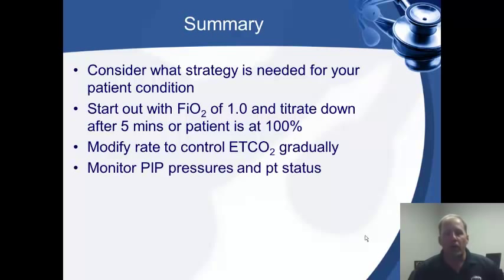Watch your peak pressures. We're shooting for 30 to 35. We don't want to go much over that. If we go much over that, probably in an obstructed patient, make sure that it's still safe for your patient. Listen to lung sounds. Watch for chest rise. If you're getting good lung sounds and good chest rise, then you may need to back off your tidal volume a little bit. That's where you're going to see that.